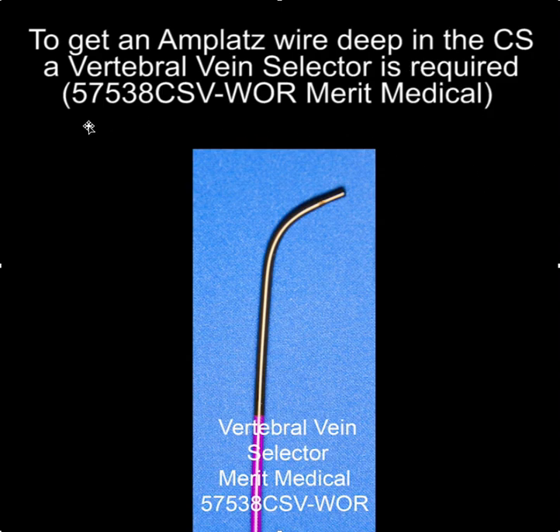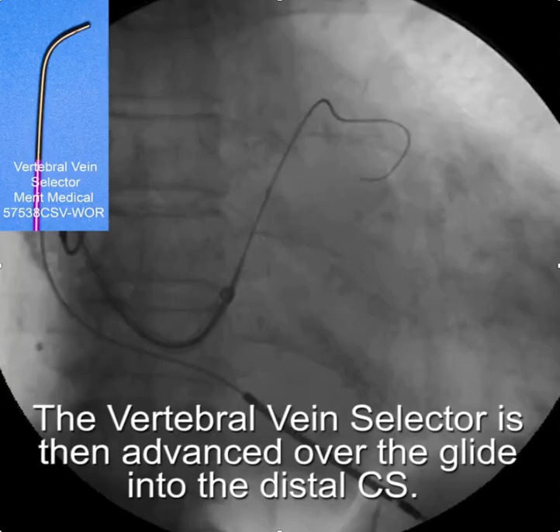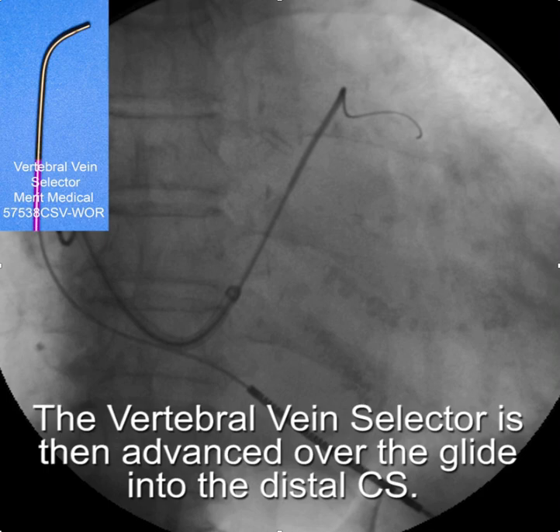To get the AMPLAT wire deep in the coronary sinus, a vertebral vein selector or some other conduit is required. I use the vertebral vein selector because I like its pushability and steerability. The first step is to get an angled 0.035 glide wire into the coronary sinus and out into the anterior interventricular vein, being careful to avoid the vein of Marshall. Once you get the glide wire in, the vertebral vein selector is advanced over it into the CS.